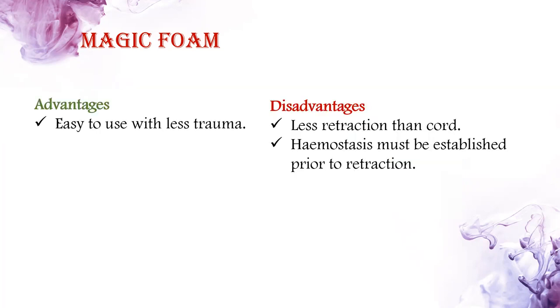The advantages: easy to use with less trauma. Disadvantages: less retraction than cord. Hemostasis must be established prior to retraction.